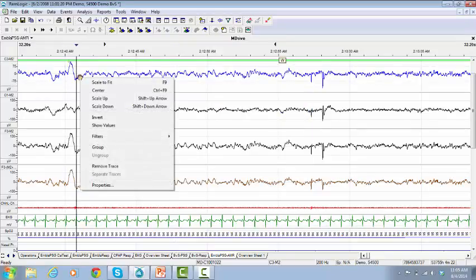To invert the polarity, right-click on the trace and click on Invert.